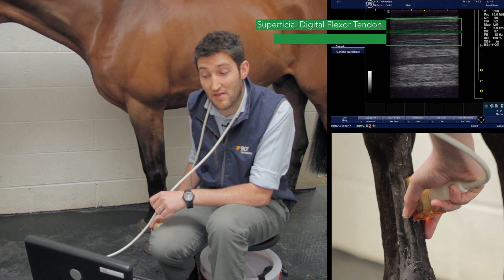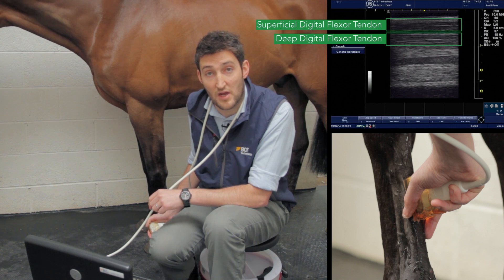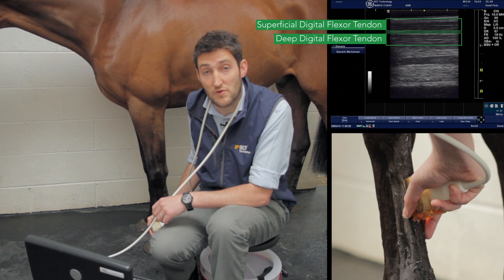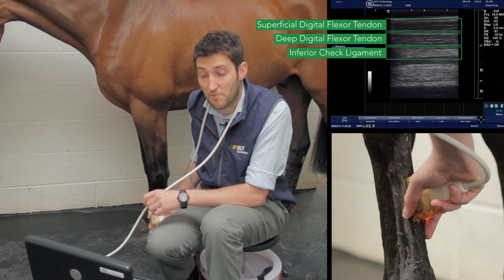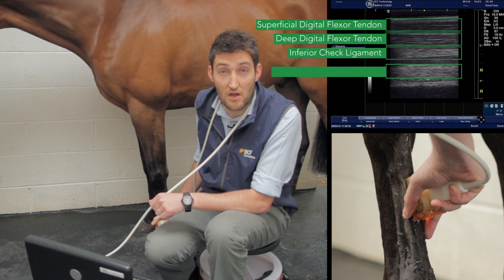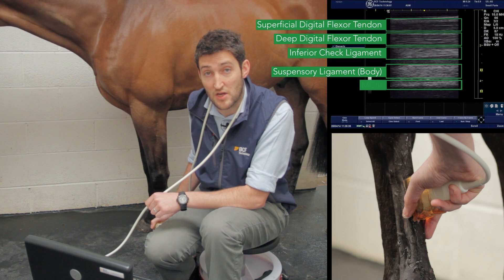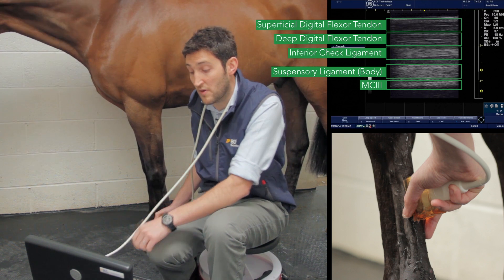In the frozen longitudinal image we have the superficial digital flexor tendon at the top, then the deep digital flexor tendon — which can sometimes be tricky to distinguish, though in this image they are quite distinct. Then we have the inferior check ligament, which is starting to thin out, a blood vessel, and then the suspensory ligament below that. Right at the bottom of the screen you can just see the palmar border of the cannon bone.